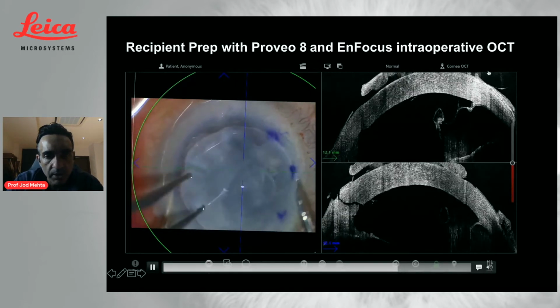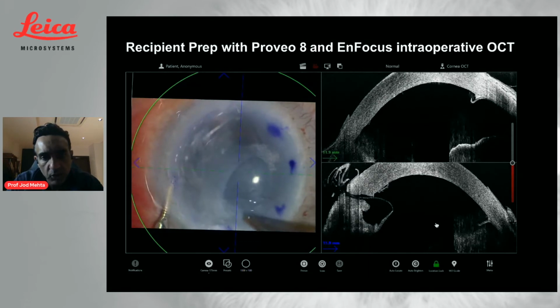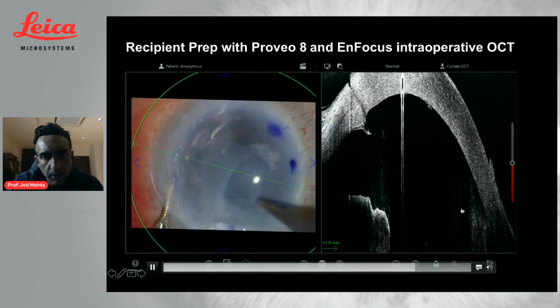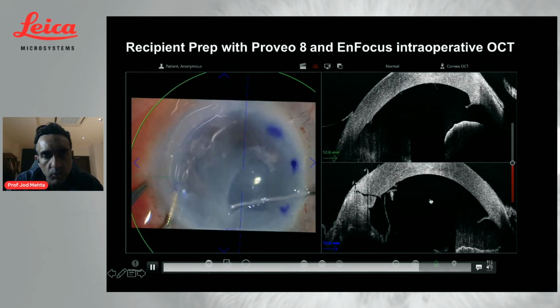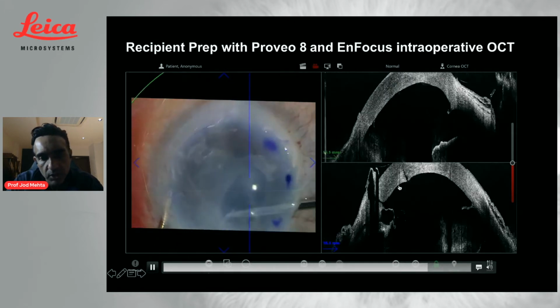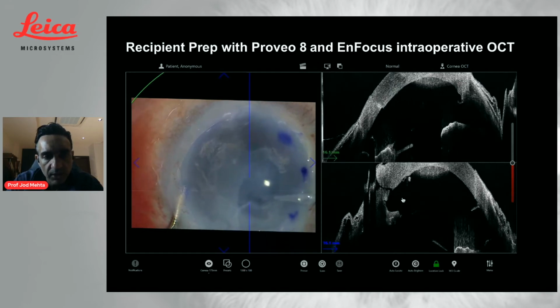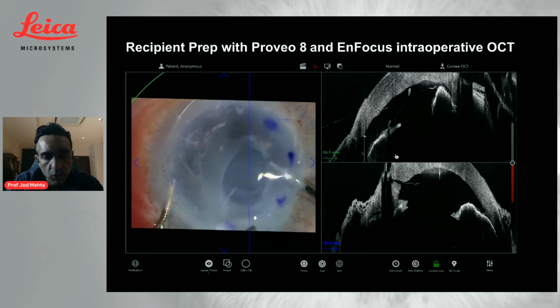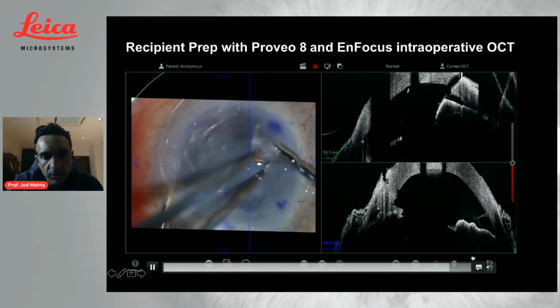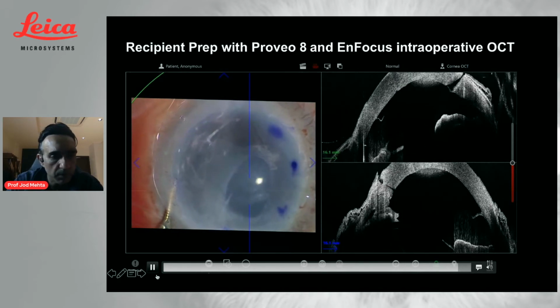Okay, so this is your old DSEK tissue. Then again, we're going to have a look now to see if there's any remnants of Descemet's membrane inside the eye. As Luigi said, it's important to remove these extra remnants of Descemet's membrane because it will affect the adherence, not necessarily of your DSEK tissue, but certainly if you're doing DMEK, it's going to affect the adherence of your DMEK if you have these free edges. So it's important to make sure you can remove these small fragments because it will affect the adherence of your graft onto the back of the recipient tissue.